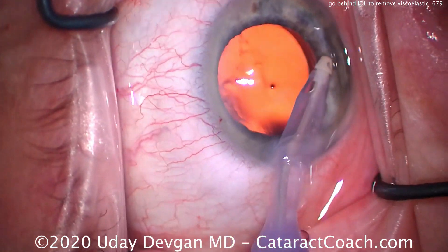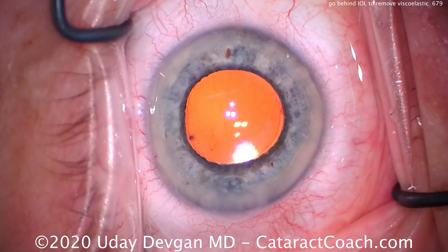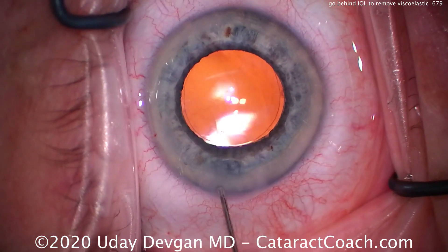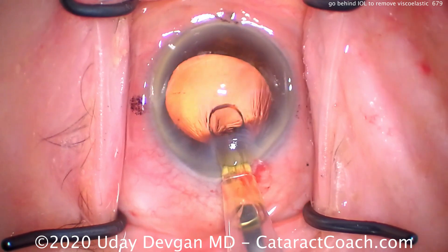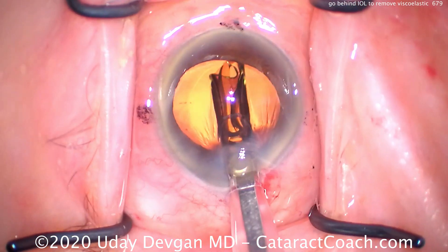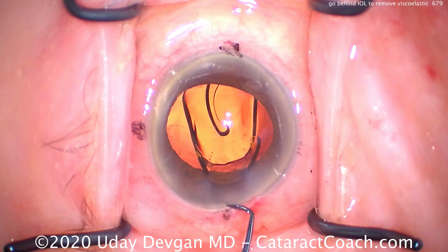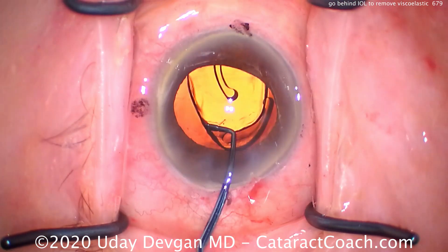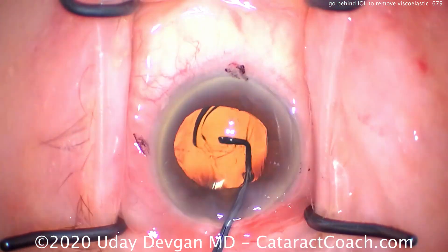So the question is, do you have to do it? It depends on the case. If you're a new surgeon who's starting off and has done fewer than 100 cataracts, it's perfectly acceptable to not do that — just tilt or rock the optic back and forth and try to express as much viscoelastic as you can that way. But as you get better and more confident with your intraocular skills, it does become important to remove that viscoelastic.